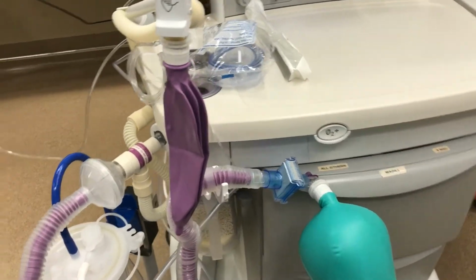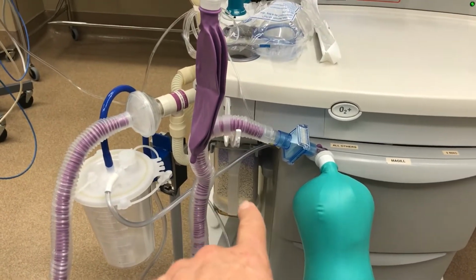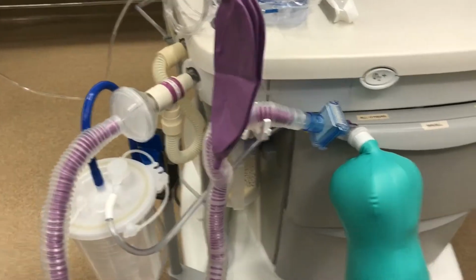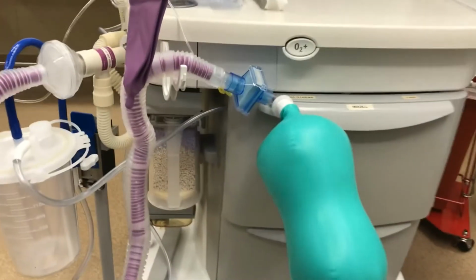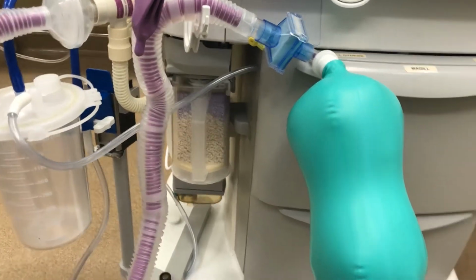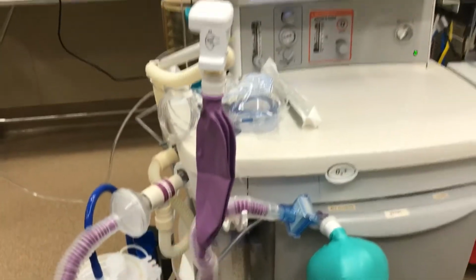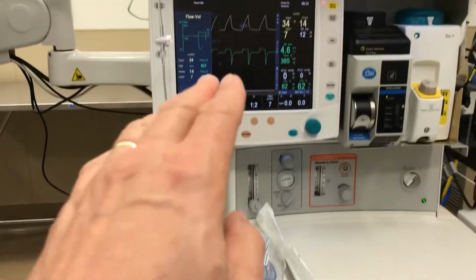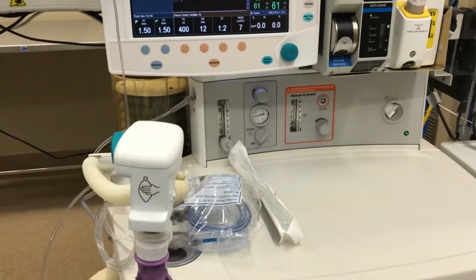Now, the only thing we need to get rid of is carbon dioxide, and that is scrubbed out in this soda lime absorber. That soda lime has a definitive life, and as you can see, this one's already started to turn purple, so about 1/4 of it is used up. The more gas we recycle, the more the soda lime gets used, but also the less oxygen and air that we consume in the system as well.